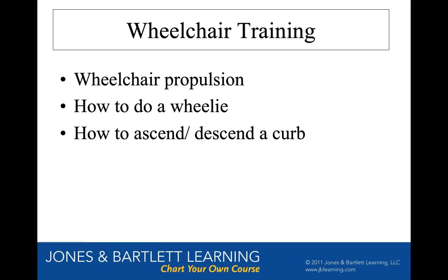So y'all get to see those pretty soon. So that'll be exciting. You get to see different types of chairs. When we get those, I want you to pick it up, feel how heavy it is, and then try picking up one of our other black folding frame wheelchairs. You'll appreciate the difference that people have if they've got to propel those wheelchairs manually. They like the lightweight chairs because it takes so much less energy out of their day, and they can get through their whole day propelling a lightweight chair. So, any questions on wheelchairs before we move on to gait training?